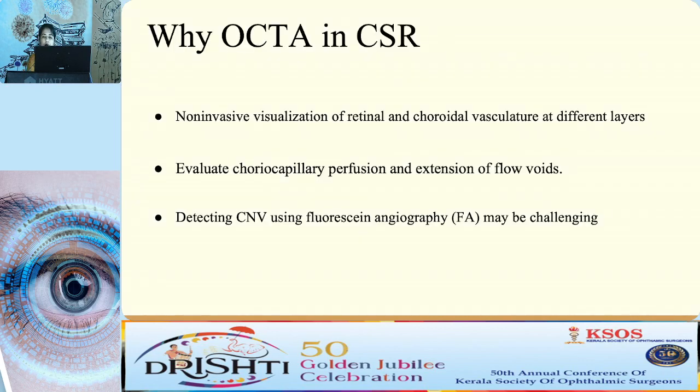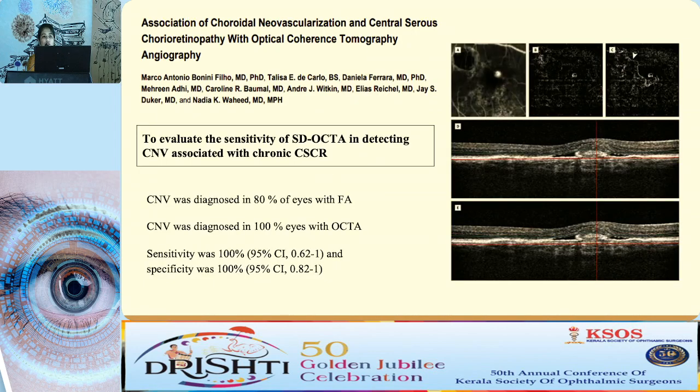So why OCTA? OCTA is a 3D non-invasive imaging modality which helps in visualization of retinal and choroidal vasculature, as we were hearing till now. It helps to evaluate the choriocapillary perfusion and the extension of flow voids. It helps in detecting CNV much more evidently than a fluorescein angiography. Why? Because fluorescein angiography will have already existing features from the primary diagnosis of CSCR. So over that, finding out a CNV is a bit challenging.